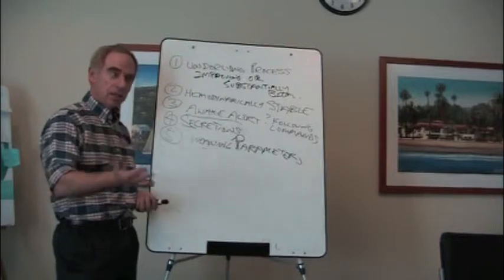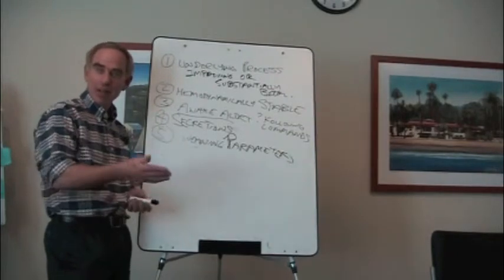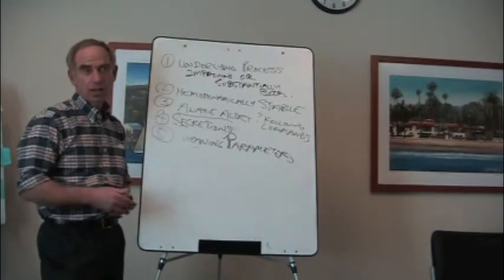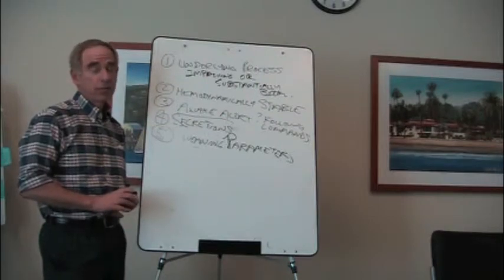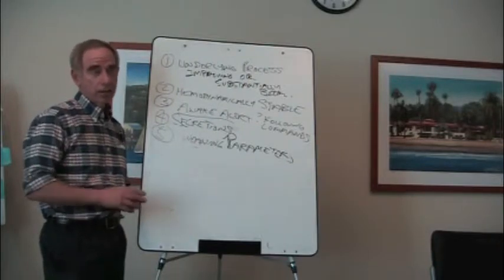Okay, so it tells you something when it gets back to the secretion management. It's actually a measurement. I said we would come back to some of that. This is it. That's an objective measurement, aside from the white card test, that can tell you how well that patient is going to be able to generate a cough. Because if they can't get a good vital capacity, they're not going to be able to produce a good cough. What about the tidal volume? What does that tell you?